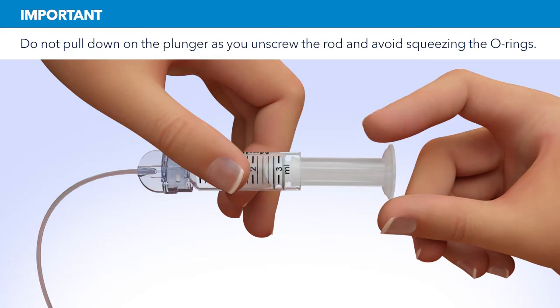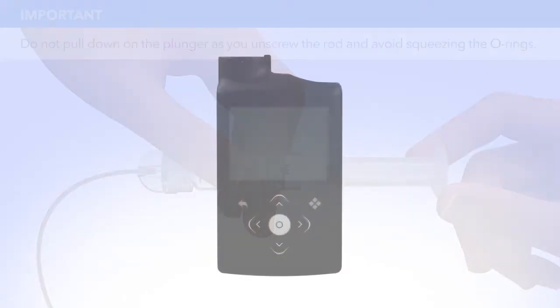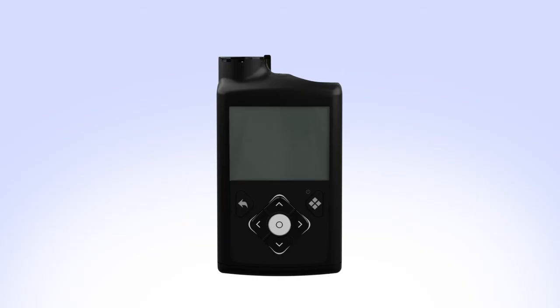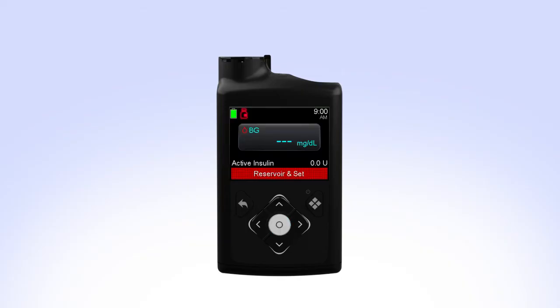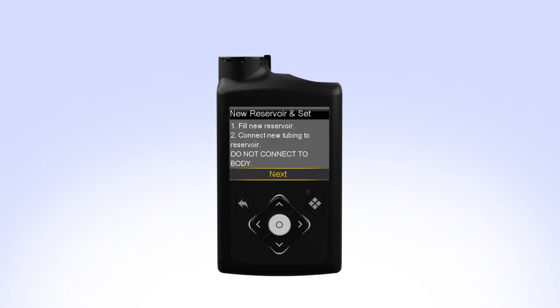Unscrew the plunger rod counterclockwise until it completely separates from the reservoir. While you are filling your reservoir, the backlight may have turned off. Press the Select button to turn the screen on again. Press Select to go to the menu screen and then select Reservoir and Set. Since you have already filled the reservoir and connected the tubing, select Next.